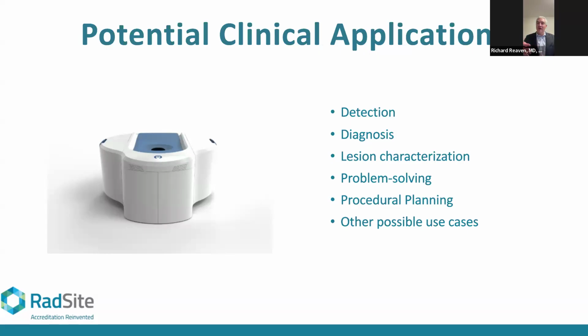And we're not doing all those additional images, right? We're not doing the implant displaced views. Everything is done in one fell swoop. And the third benefit here is that we're actually able to detect any rupture of the implant itself. We can see the implant extremely well on breast CT, and we can identify implant rupture or integrity very, very clearly on breast CT.